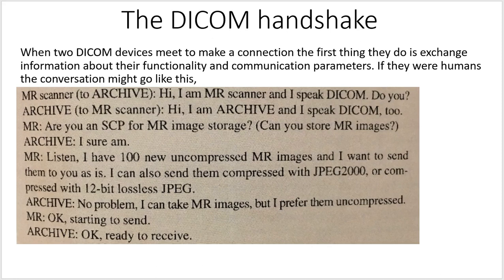And the MR machine would say, listen, I got 100 new uncompressed MR images and I want to send them to you as is, but I can also send them compressed with JPEG 2000 or compressed with 12-bit lossless JPEG. You know, how would you like them? And the archive would say, no problem, I can take your MR images, but I prefer them uncompressed. MR would say, okay, starting to send. Archive would say, okay, ready to receive.